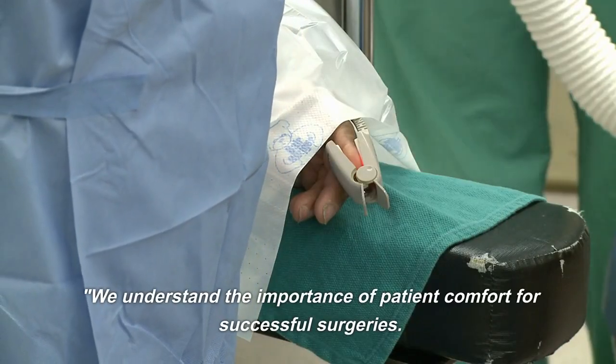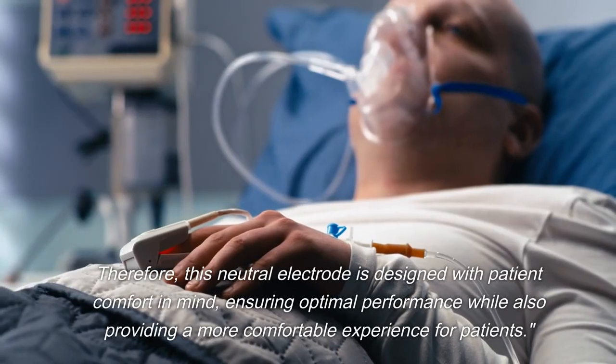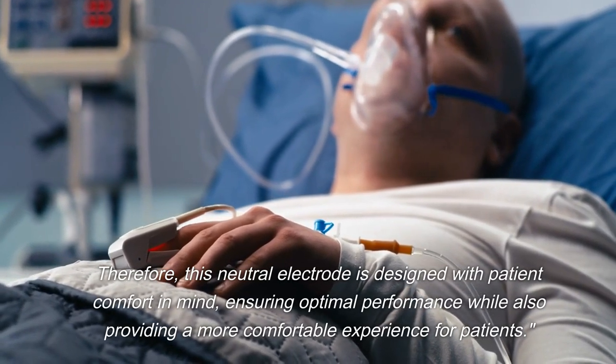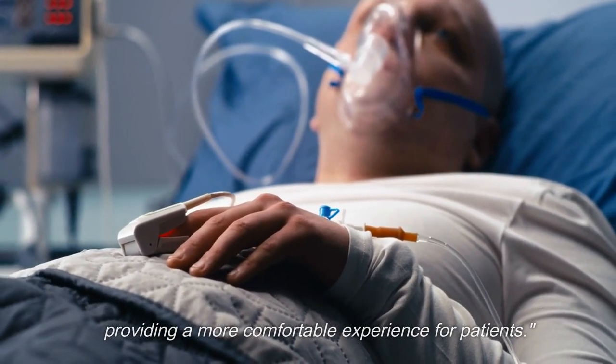We understand the importance of patient comfort for successful surgeries. Therefore, this neutral electrode is designed with patient comfort in mind, ensuring optimal performance while also providing a more comfortable experience for patients.